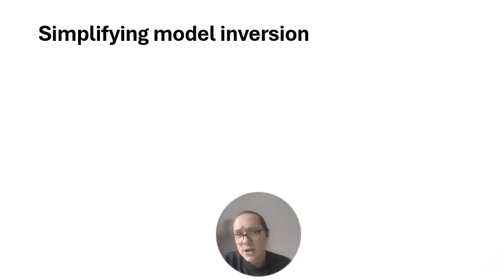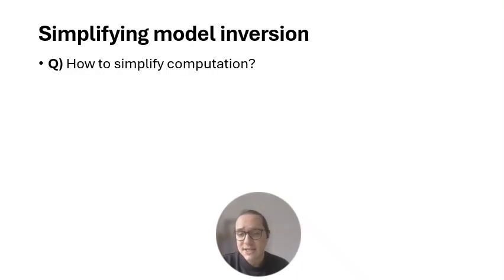So when we're doing our model inversion, what we're trying to do is estimate parameters that are going to best simulate the fMRI data that we have, essentially. But as I've said, if we try and do this in the time domain for resting state fMRI, it's going to be very complicated because of these endogenous neuronal fluctuations. So how can we simplify this inversion?